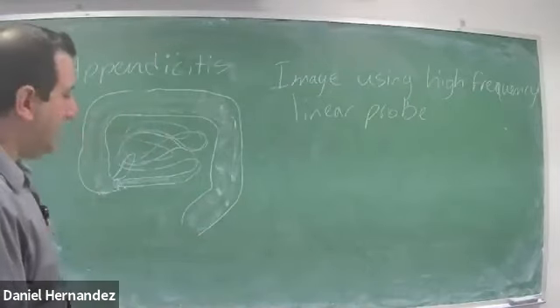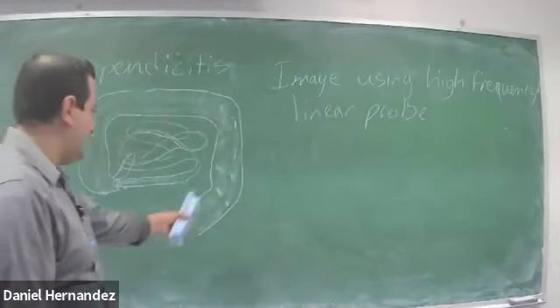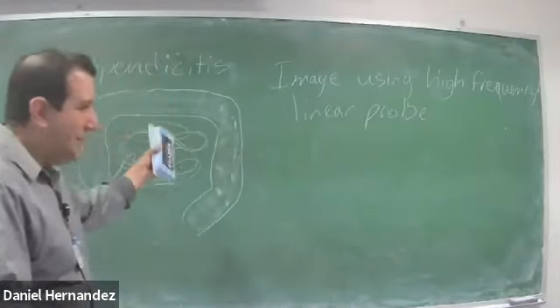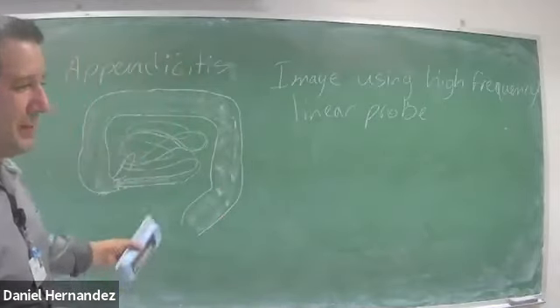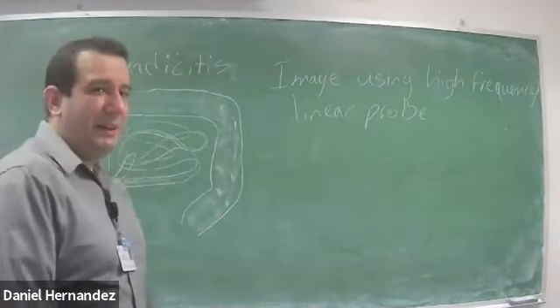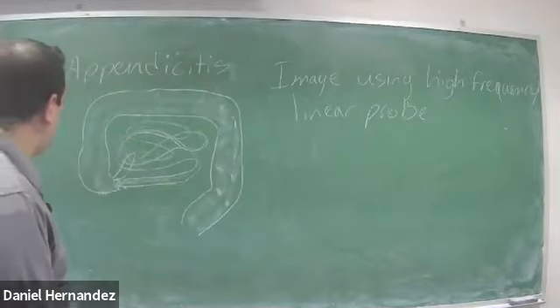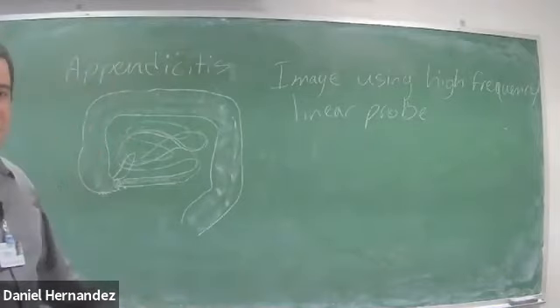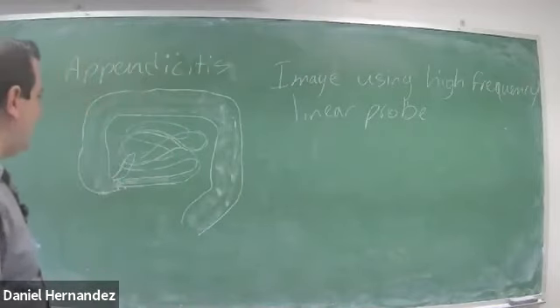So I got that kid up here for the exam, and I took some pictures on the left side just to show that there was no mass, no fluid, looking for a potential area of pain, what could have been there. And then I got to talking to the mother, and she informed me that the patient actually had an appendectomy about 3 years prior. So I don't even know what they were telling him.